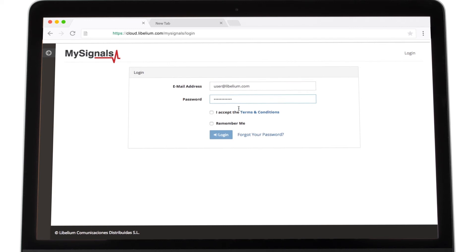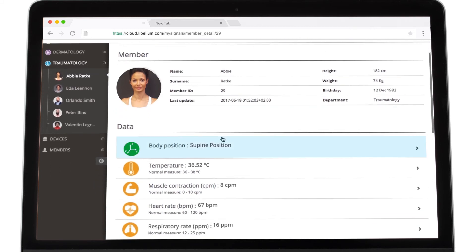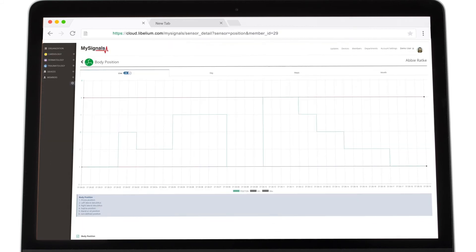Once you access the MySignals website, the Member Profile page appears. Select the sensor you want to use to see the data.